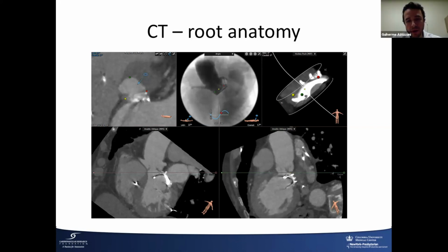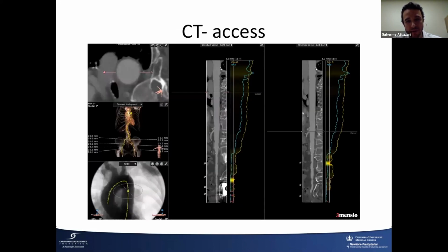Okay. One important thing, of course, because of the protrusion of the mitral valve, but also because you don't have calcium, you want to make sure you do a shallow implantation to maximize the oversizing. Otherwise, if you go deep, assuming you don't have the mitral valve in place, like any other case treating pure AI, you have to be careful that you need to go shallow to maximize the oversizing and prevent the valve from moving ventricular.